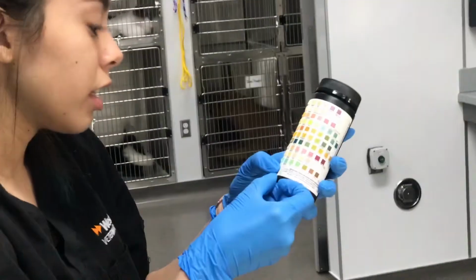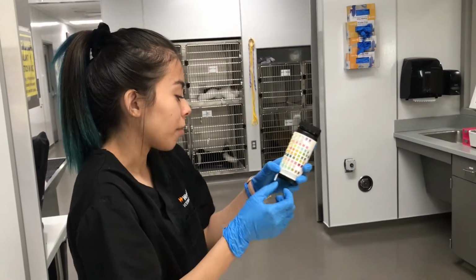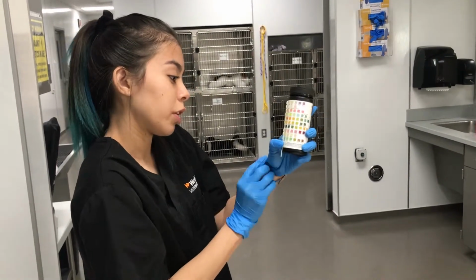So this bottle indicates to wait 30 seconds to start determining the glucose and bilirubin. So I'm going to wait those 30 seconds.